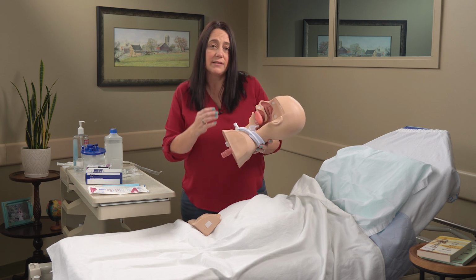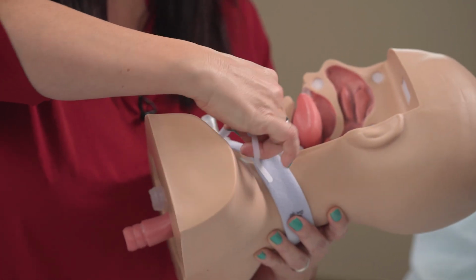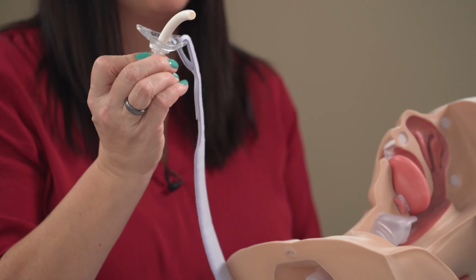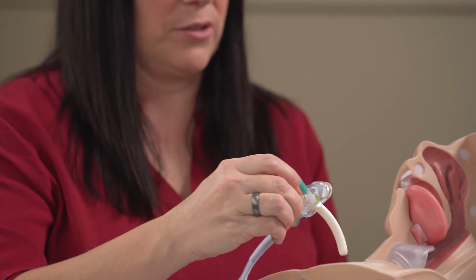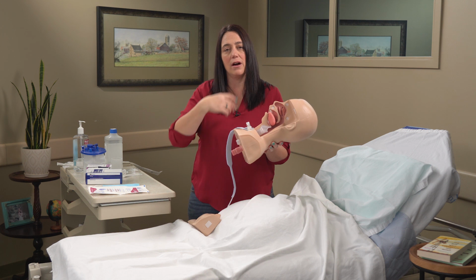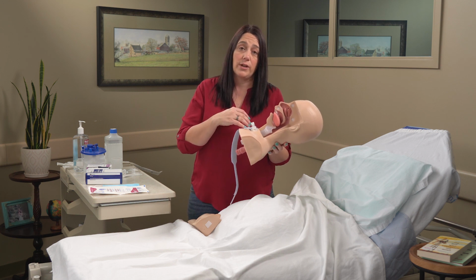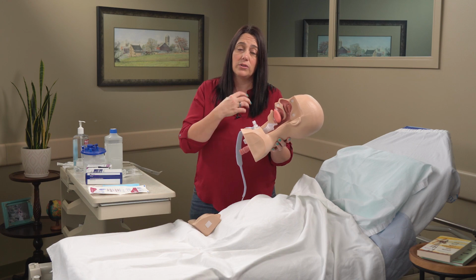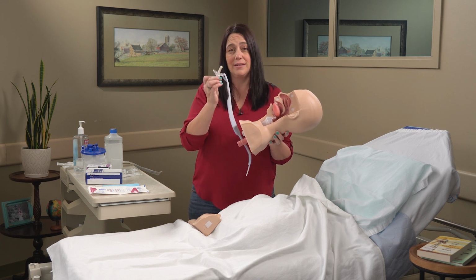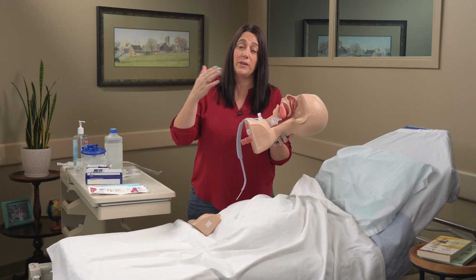When that opening is placed, it's basically a hole that's made into there. And then what they're going to do is take a device that's basically like a straw. It's open all the way through the middle, and that is placed into that hole and helps maintain the airflow from the outside world into the lungs and helps the body expel it back out. Without this, that hole or that incision that was created, that ostomy site, would begin to try to close on its own. So the device has to be left in place to keep that site open so that person can continue to breathe. So that's all it is. It is as simple as a straw that's placed into that person's trachea to help them keep breathing and keep their airway open.